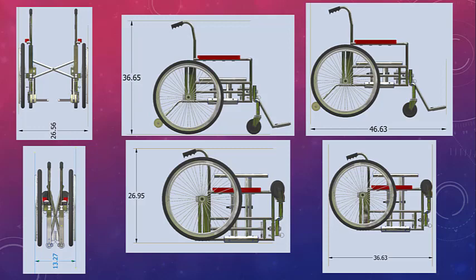As far as raw materials go, my frame is made of a 7/8 inch 6061 aluminum tubing due to its versatility, strength, and ease of machinability. To secure the frame together, my frame is cut and welded together very similar to a bicycle frame. All metal featured on the chair is 6061 aluminum because of the before stated strength and versatility. All tubing is to be cut and welded together, and the back channels for the wheel blocks are to be machined out with a CNC machine.